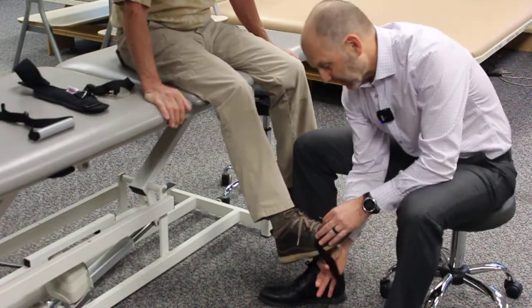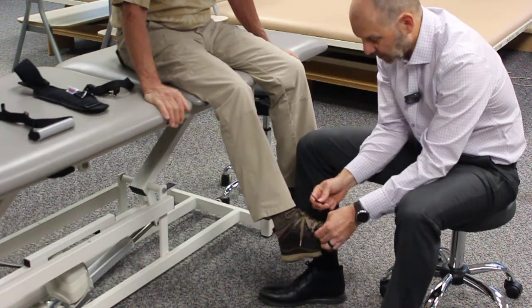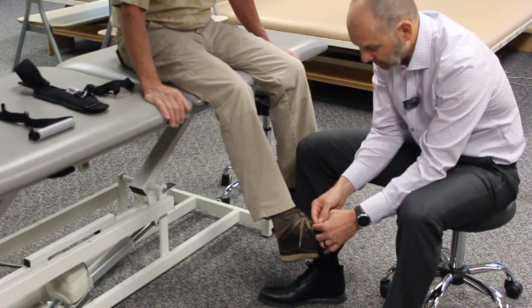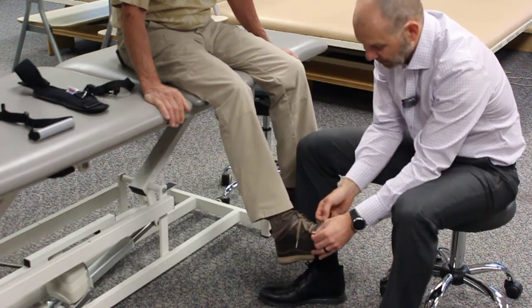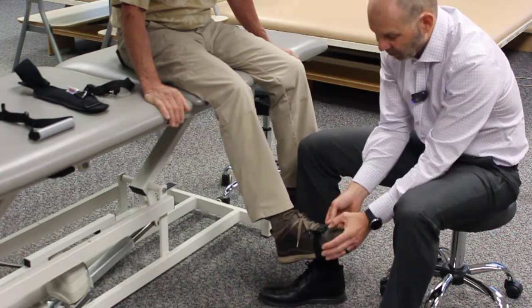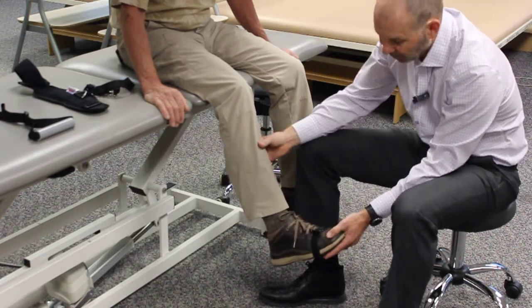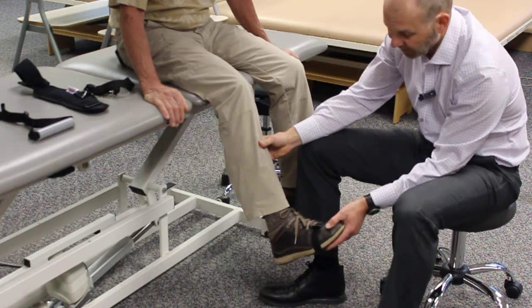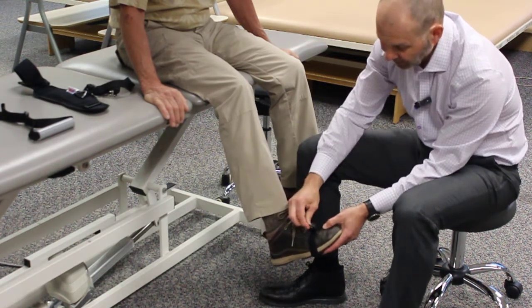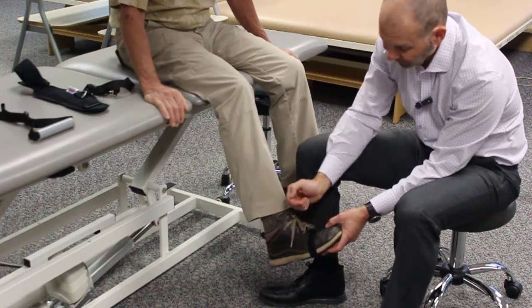So you're just going to take this strap, place it around the foot, just around the widest part of the foot, the metatarsal heads, and put your Velcro strap on there. Depending on what angle of pull you want, if you want to pull more out to in, which most of the time you don't, you would mount it so that the little triangle that you're going to hook the Easy Step to is more towards the outside of the foot.